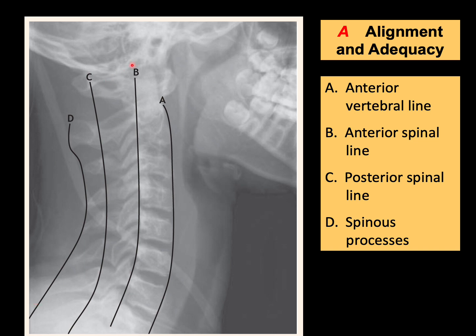For adequacy, you have to have a good look at the base of the skull and from C1 not only to C7 but you also need to see the upper border of T1. So: anterior vertebral line, anterior spinal line, posterior spinal line, and spinous process line — from the base of the skull to the upper border of T1.